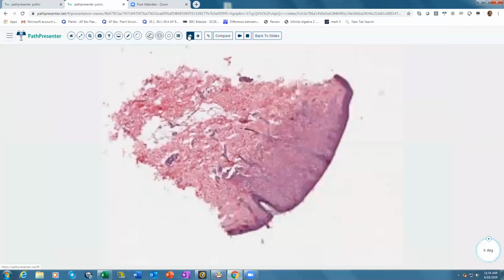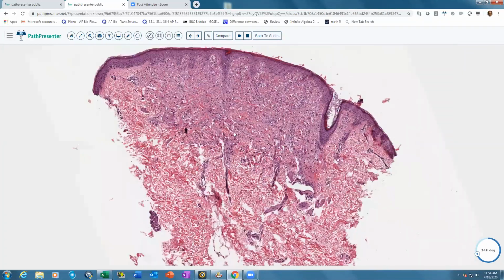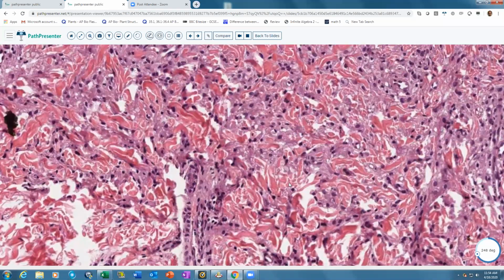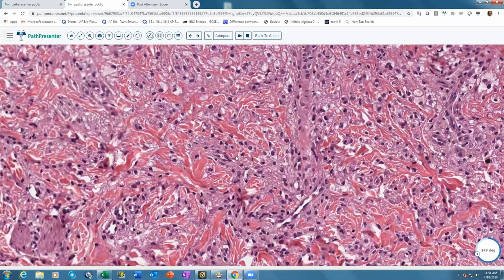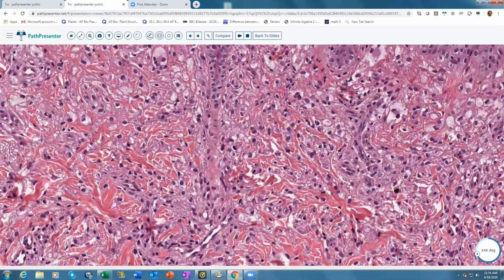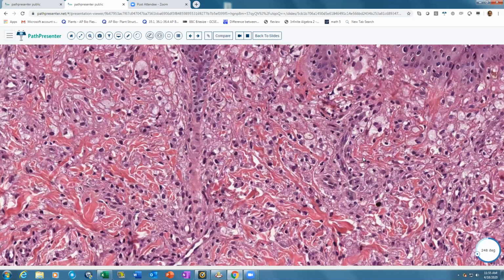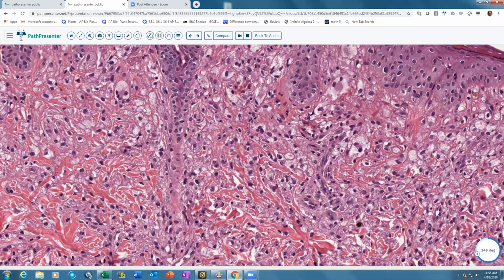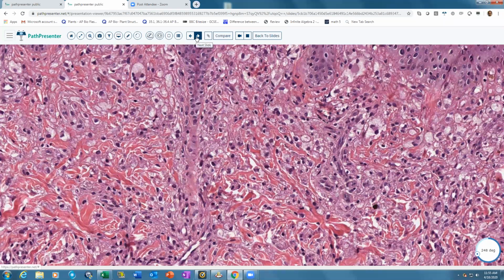Again, histologically, there's not much difference here. What you're going to again see is this xanthomatous lesion that is composed of these foam-laden xanthomatous cells that you see scattered throughout the dermis. So these are the xanthomatous cells that you see here. There might be some admixed Touton-type giant cells that you see here, one here and the other here, but nothing particularly different from the other kinds of xanthomas that we saw basically.